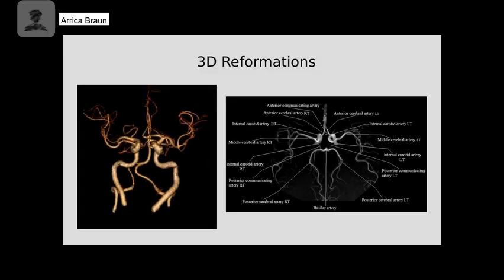On this slide, this gives an example of something that we can utilize with our CT angiography. Post-processing allows us to change our imaging and make it look different. So we can do 3D reformations of just our anatomy in the brain itself. This is a cool process because we put it into different software on a separate computer from your CT monitor. You will access the data and you will have to get rid of things that you do not want to see. And then you will highlight areas that you do want to see.